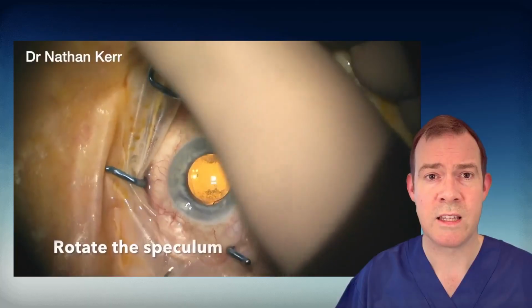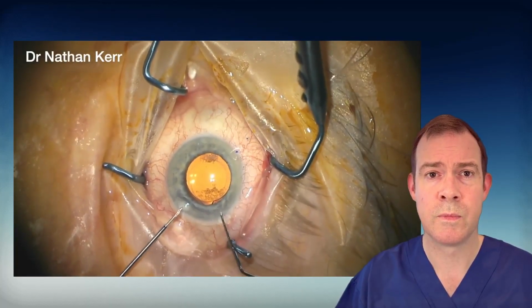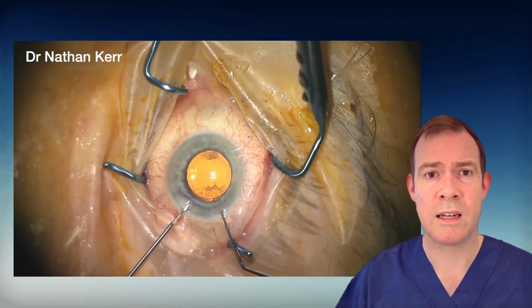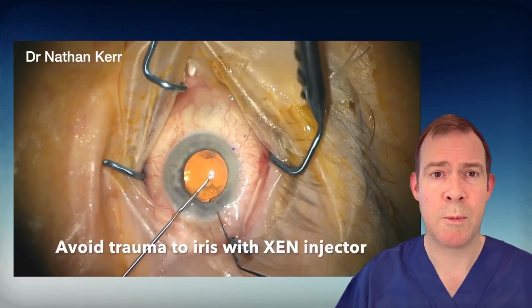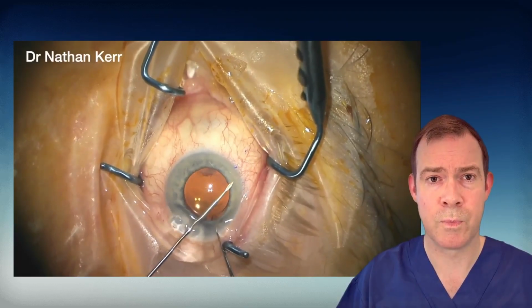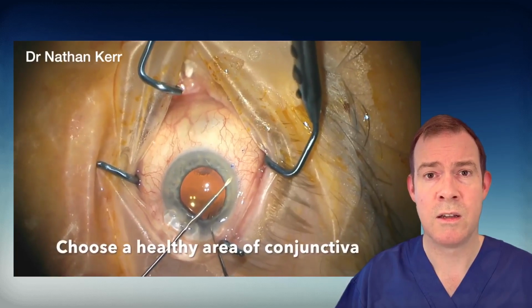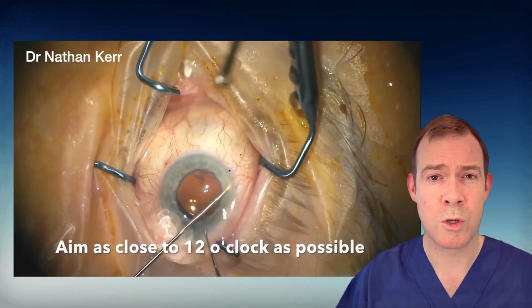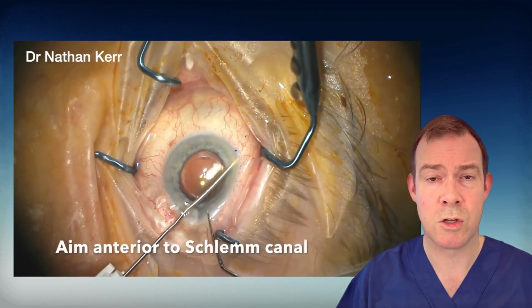And now rotating the speculum is important to give you access. Holding the globe with the second instrument and carefully inserting the injector across the anterior chamber, helping to avoid trauma with the iris or endothelium. We want to aim just anterior to Schlemm's canal, choosing a healthy area of conjunctiva, as close to 12 o'clock as possible. This can be performed as shown.